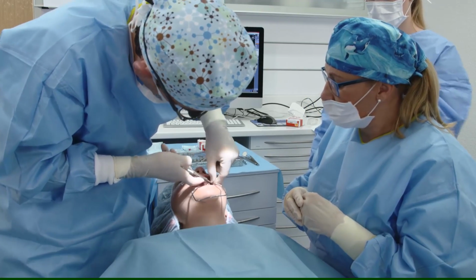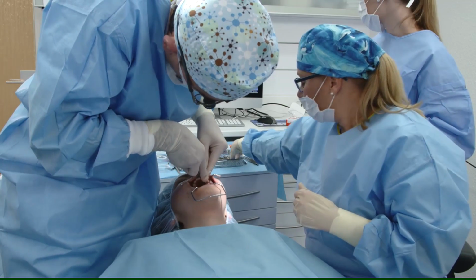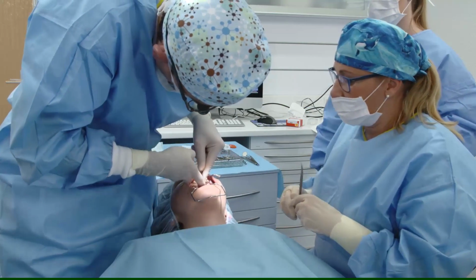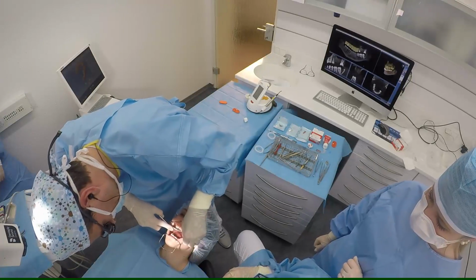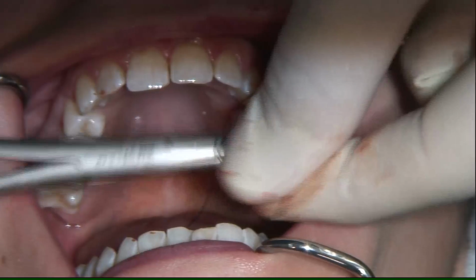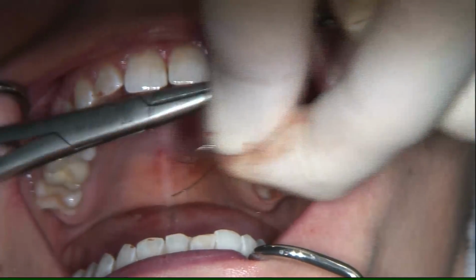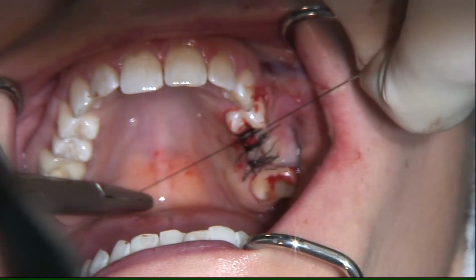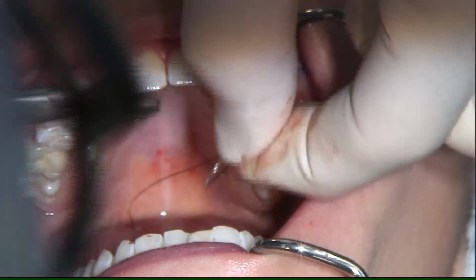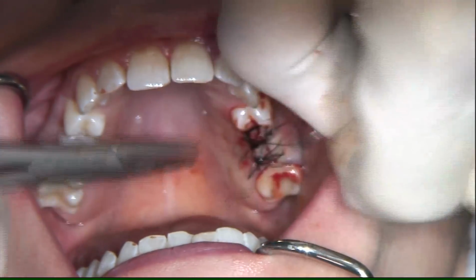So Xive is a very, very good system. Myself, I also like to work with this system. It has a good primary stability in each bone quality. It's atraumatic and gentle in hard bone of density D1 and stable and secure in soft bone, like density D4.